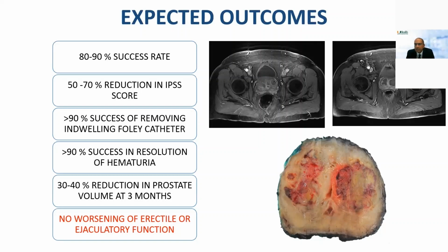On the left, there is an MRI image pre-embolization and then post-embolization. We did a pre-prostatectomy study to look at the effect on prostate cancer, which I'll share towards the end of the talk. Essentially what you see is this black hole or owl eye appearance, or just an overall volume reduction. What we saw on the explant histopathology is these areas of hemorrhagic necrosis, which will resolve over a period of time, and the prostate will just shrink. This was the pathology specimen at 8 weeks post-embolization.